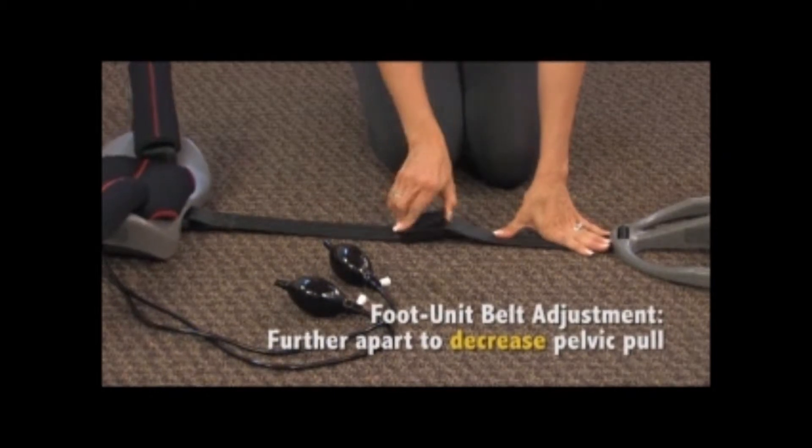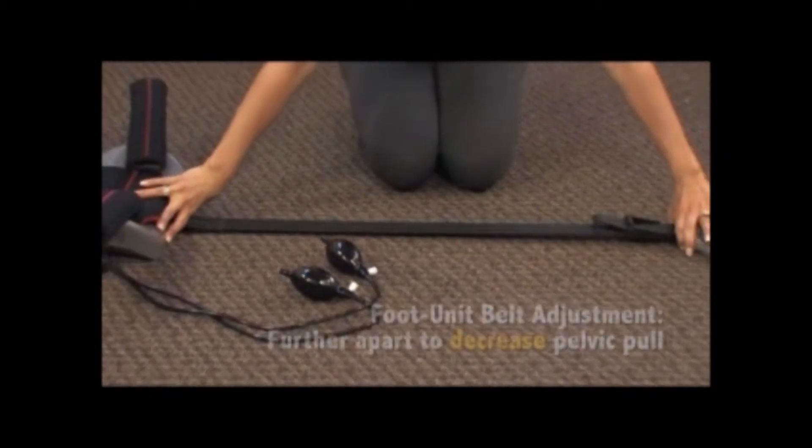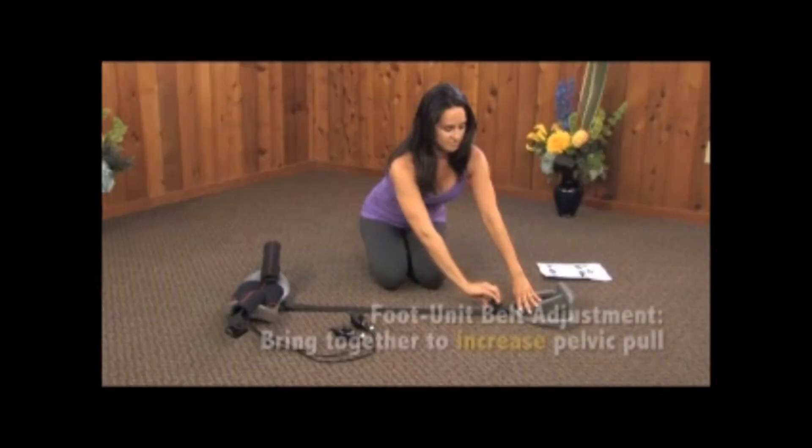To decrease pull, open the buckle flap completely and pull the foot unit away from the back unit. Then lock the buckle completely.